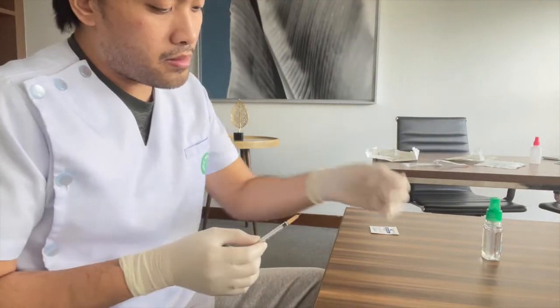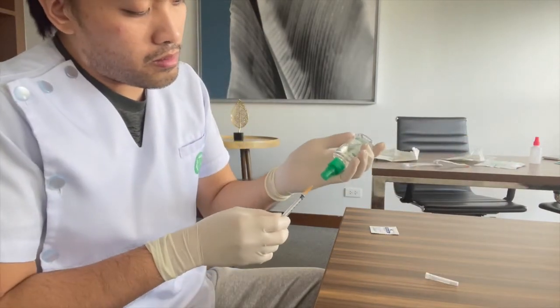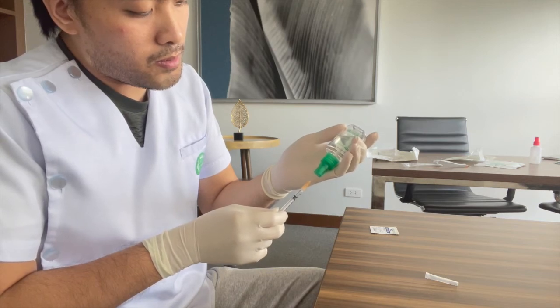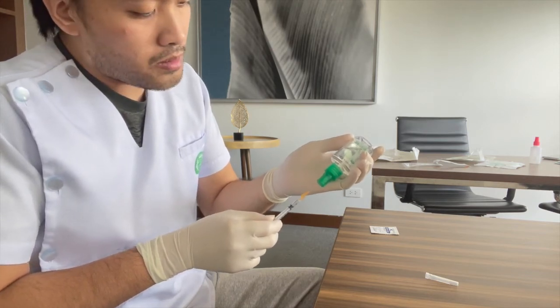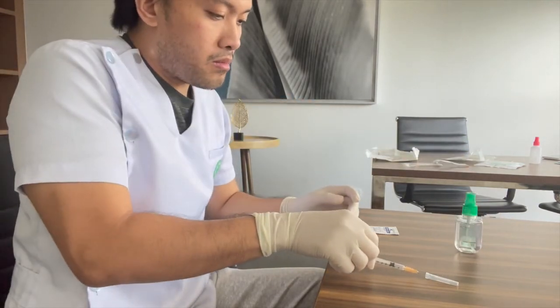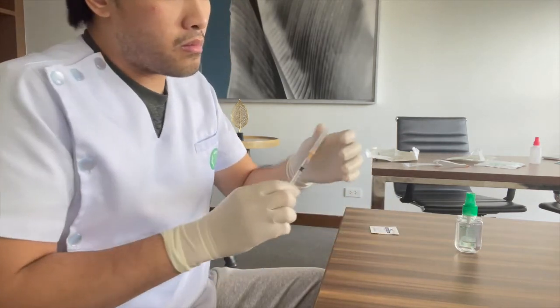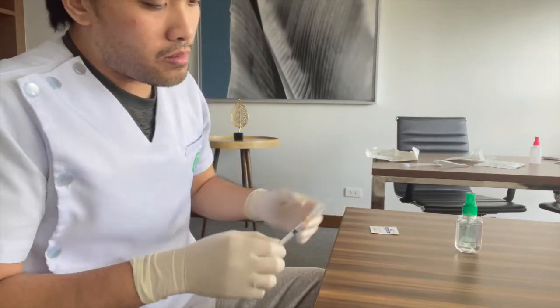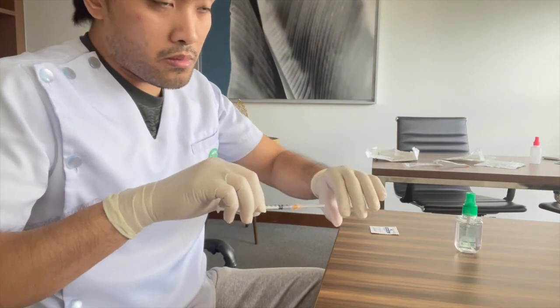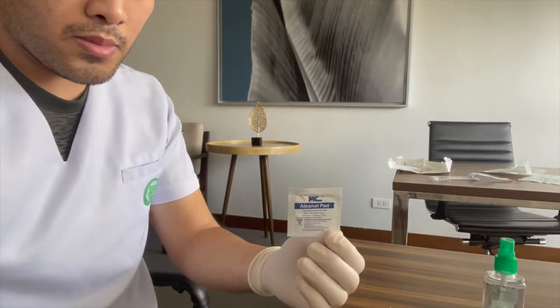So first we have the syringe. We then remove the cap, and then we extract the medication from the bottle. We make sure we place back the cap so as to not have any other injuries. We make sure that we switch needles before we administer the vaccine into the patient.